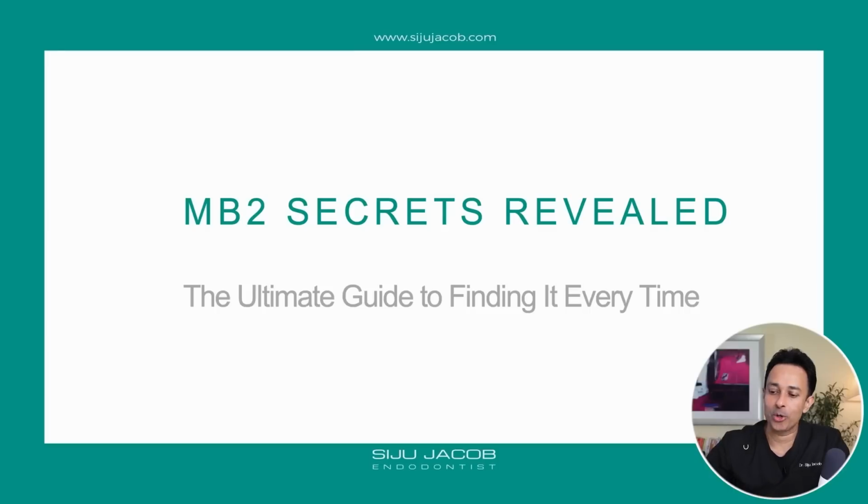So this short video is my attempt to put together a series of steps or protocols which makes it easier for the clinician to go about locating the MB2 canal in everyday clinical practice. It's called MB2 Secrets Revealed. So let's first look at some routine clinical cases that we come across in everyday clinical practice.